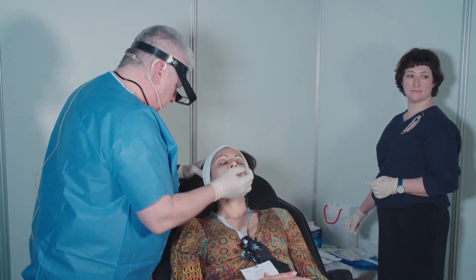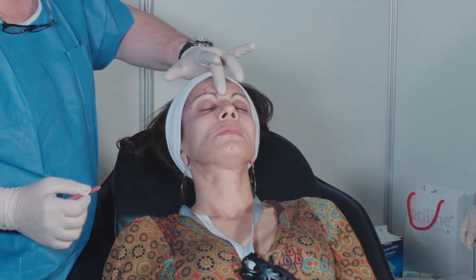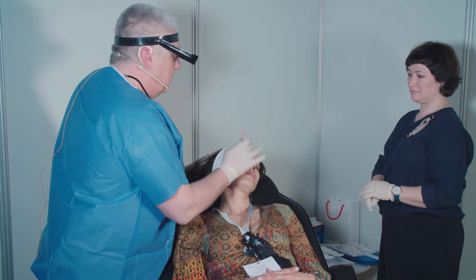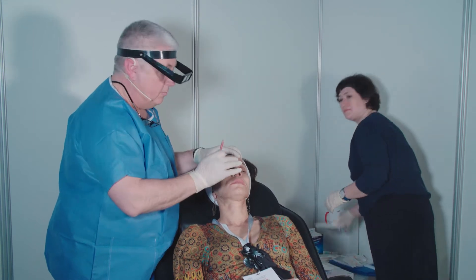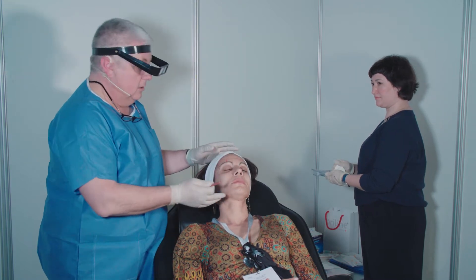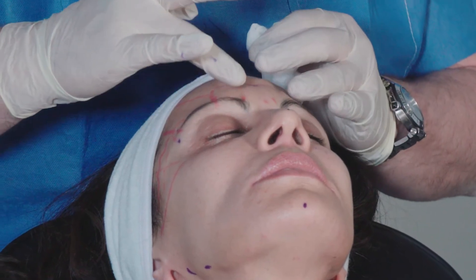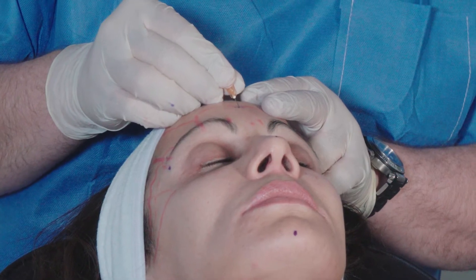So how is the decision? If you inject in the supra-trochlear area, use a cannula superficially. Here, use a needle deep. I will inject this area with the apriline normal — I will restore the convexity on the superficial plane and treat these little wrinkles. I want to use only one point here because it's enough — the depression is not so important. I just want to show you this little pre-hole.